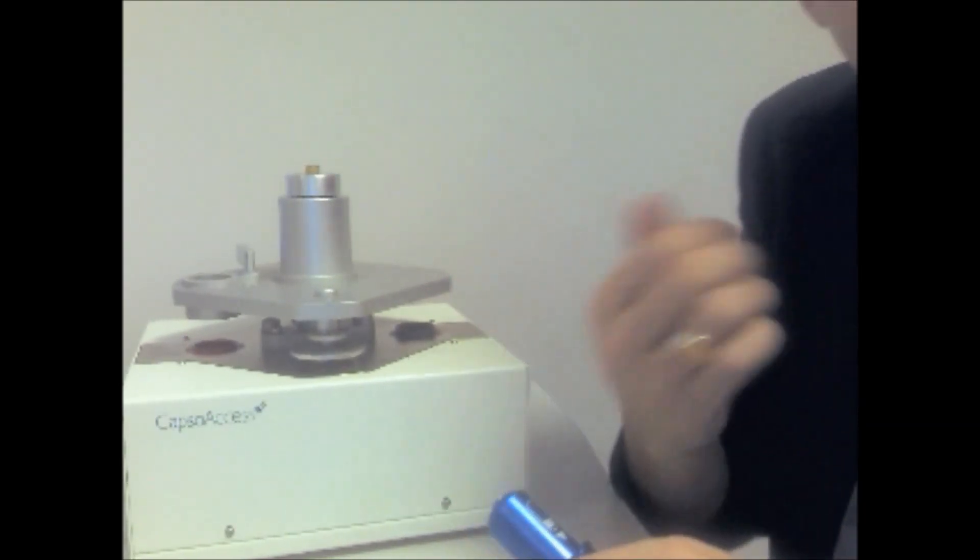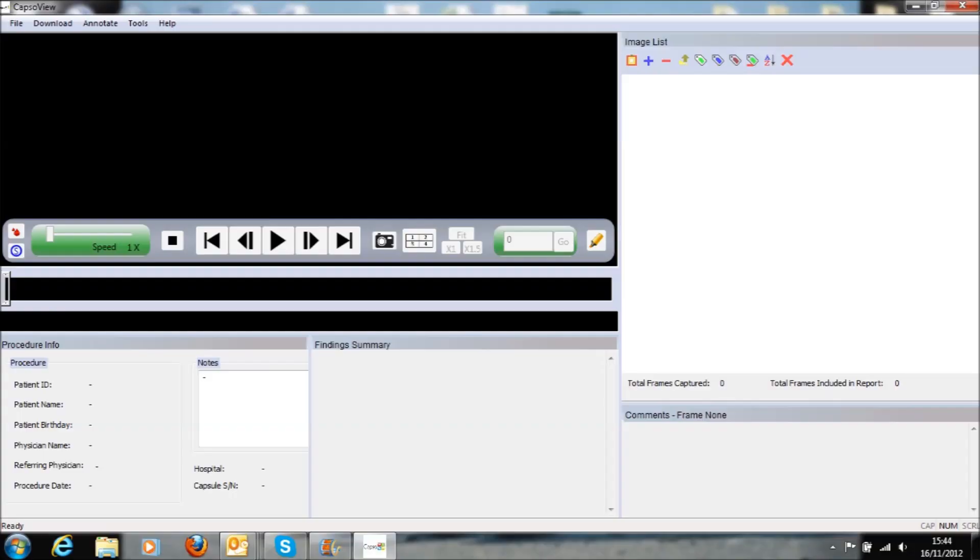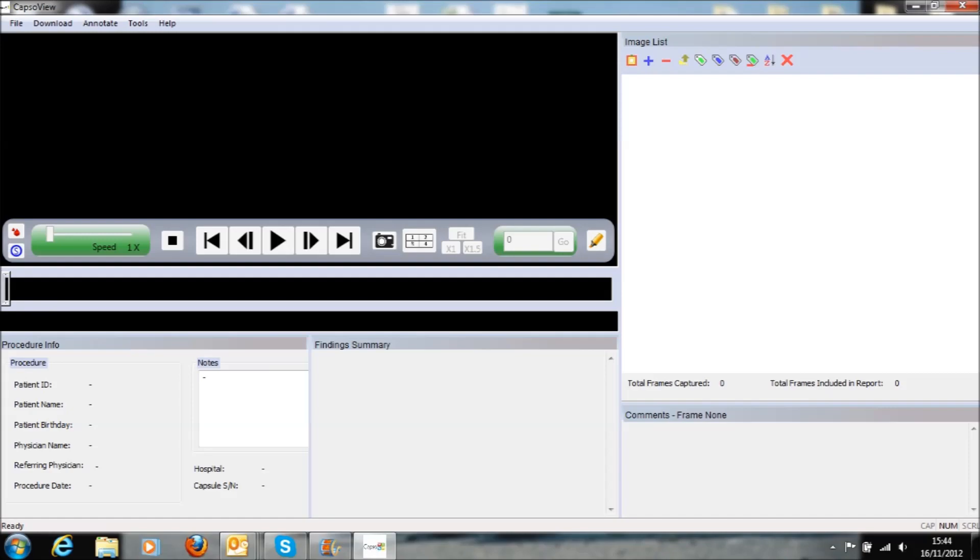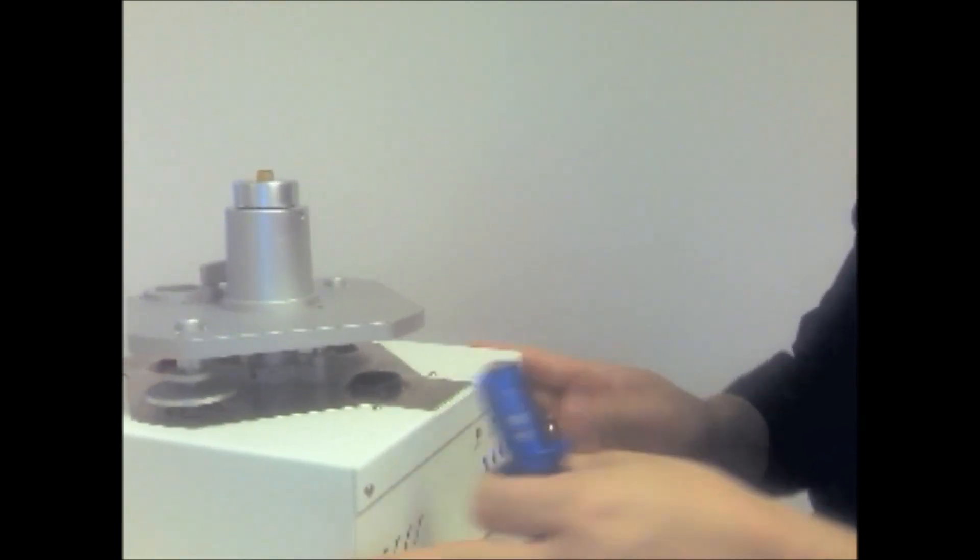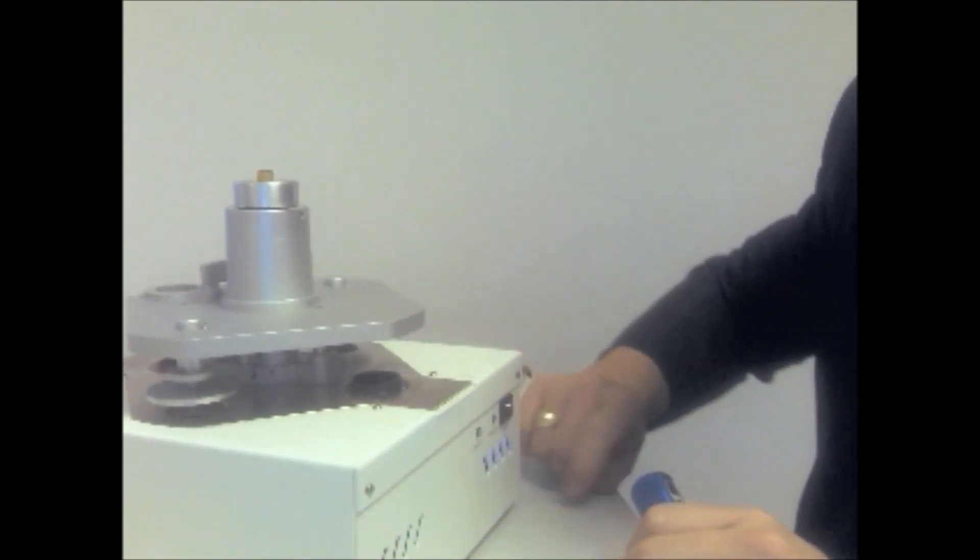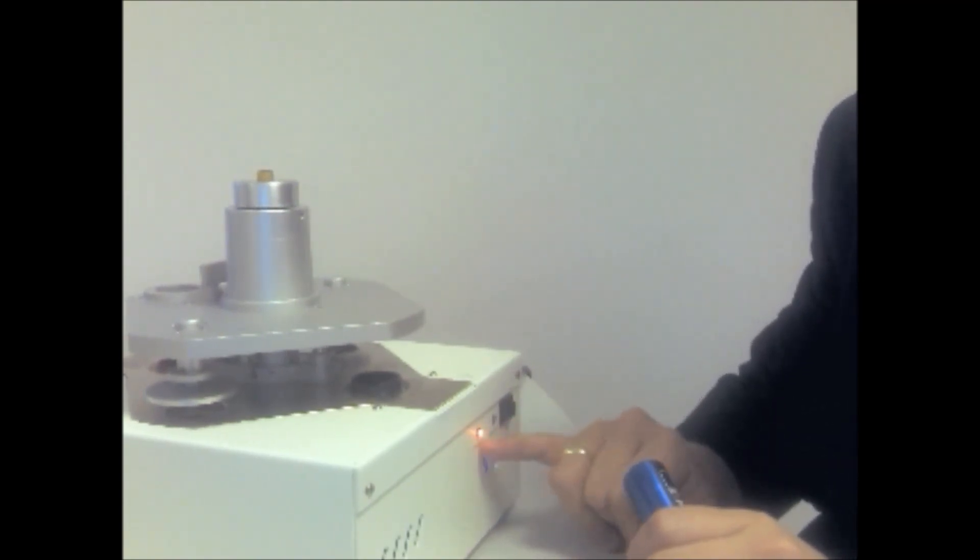The first thing to do is to load the software up on your PC and then make sure that you've switched the unit on, which is controlled via this green switch on the front. You should then get a status one orange light appear on the unit.